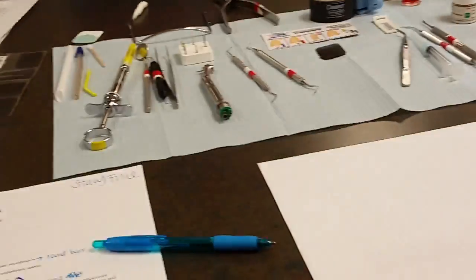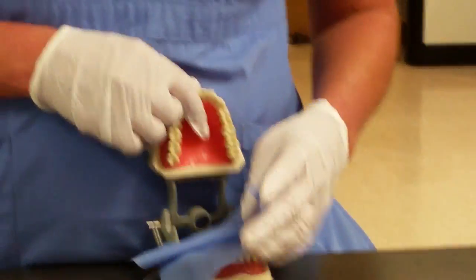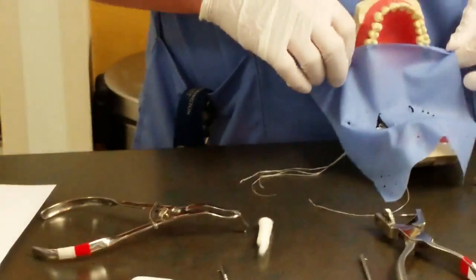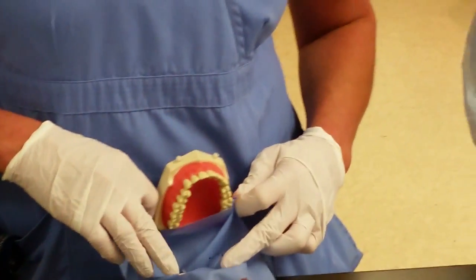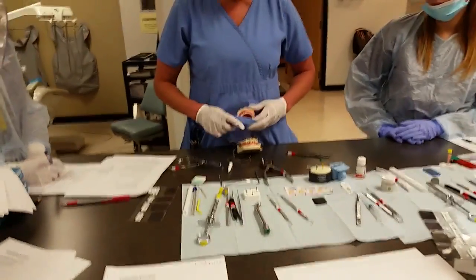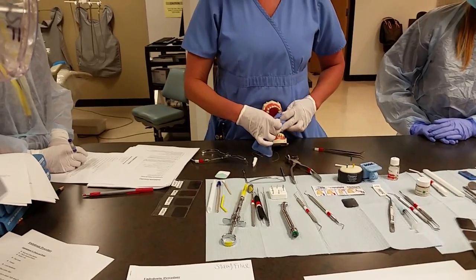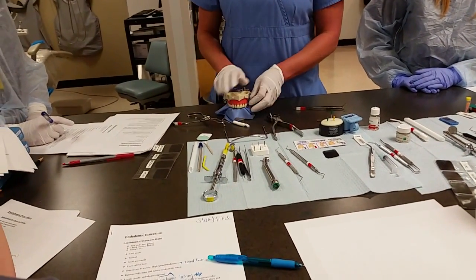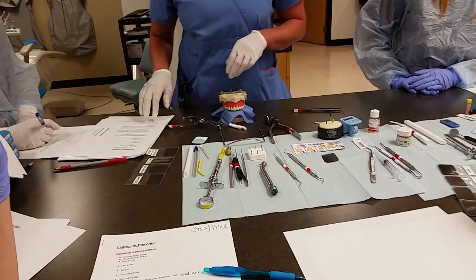The dam clamp clamps onto the tooth. You wouldn't put that on when they're not numb. Once it's applied, all we see is that one tooth exposed through the rubber dam. For endodontic patients this is ideal because all we need to look at is that one tooth, and we want to keep the rest of the mouth dry. You go underneath it and just lift it really quick and then suction it out.